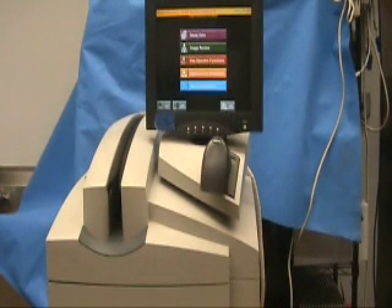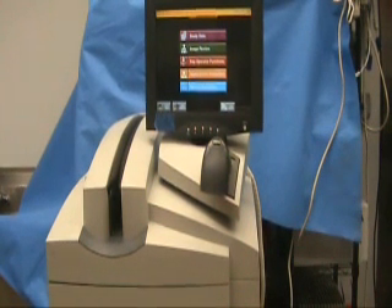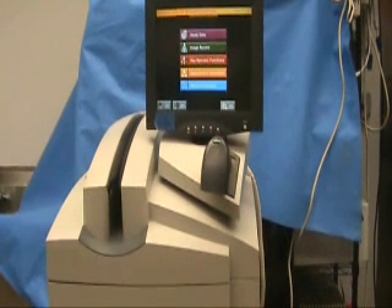The CR uses special cassettes that contain a phosphor screen instead of film, but they are the same physical size and come in all the same variety of sizes as a standard X-ray: 8x10, 10x12, 14x17, etc.